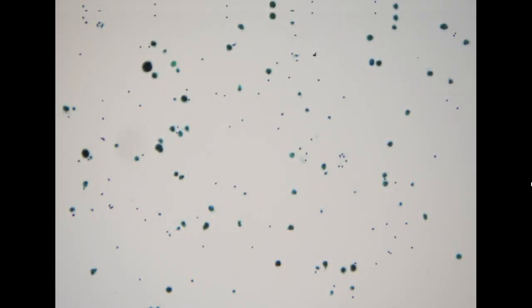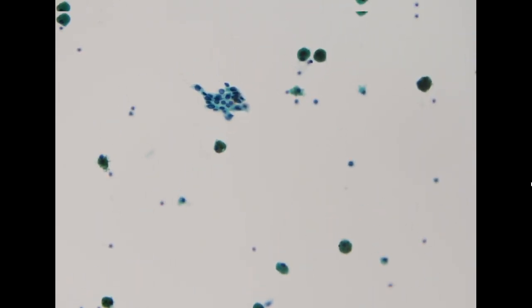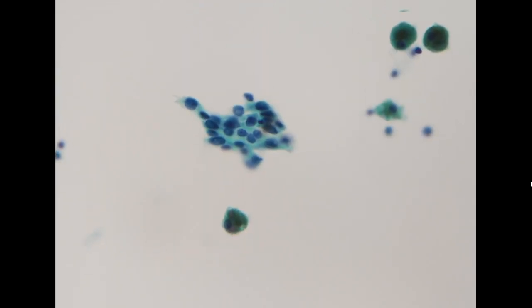So the patient actually came to our hospital because he found a nodule in the thyroid. The clinician did the sono and identified a tumor within the thyroid, plus some lymph nodes with cystic change. So they decided to aspirate the lymph node instead of the primary thyroid nodule. We pay attention to the background, and we realize that these are cystic, this is abnormal.